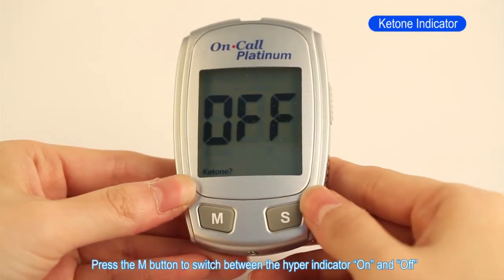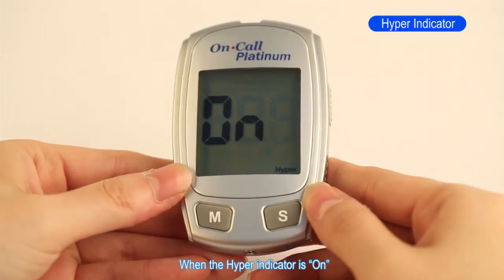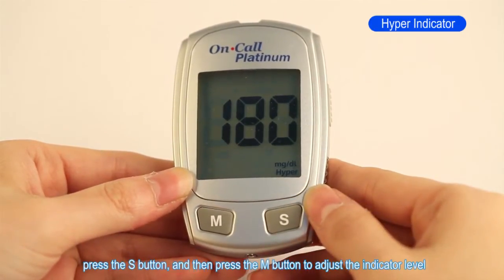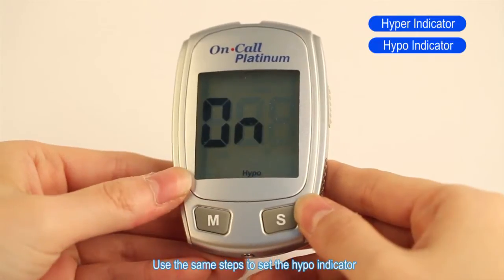Press the M button to switch between the hyper indicator on and off. Press the S button to confirm your selection. When the hyper indicator is on, press the S button and then press the M button to adjust the indicator level. Press the S button to save your choice. Use the same steps to set the hypo indicator.